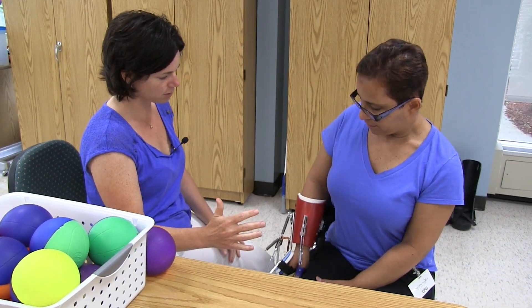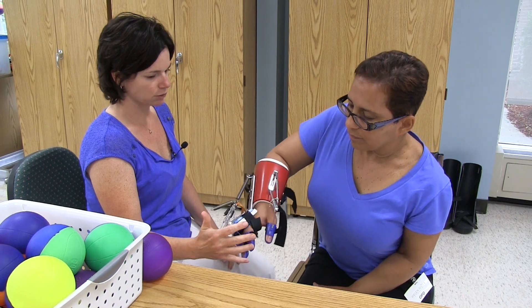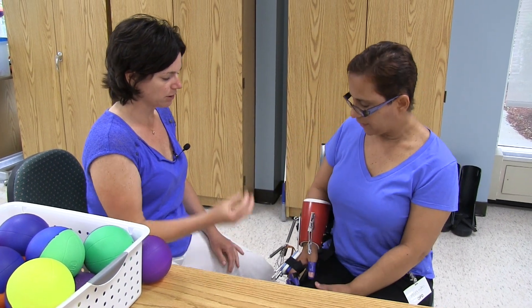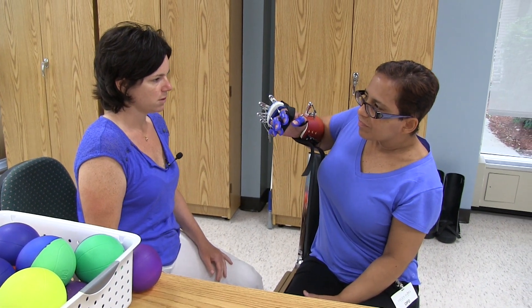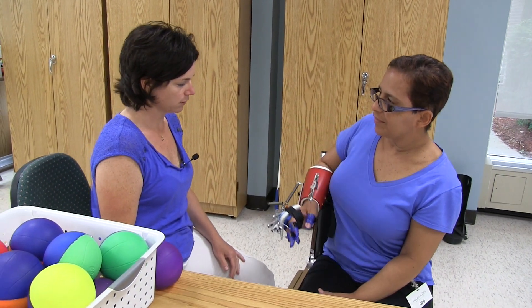Come reach forward, reach towards my hand — there's her shoulder motion. Bring your hand up to your mouth, hand up to her mouth, bring it down. Good.